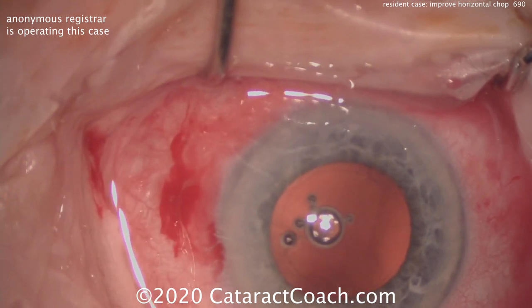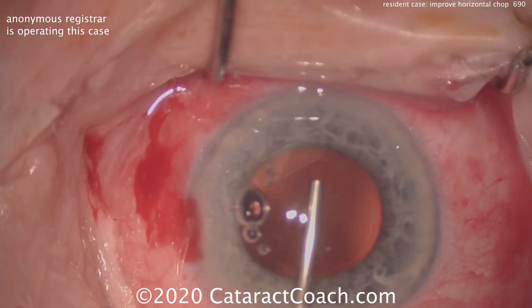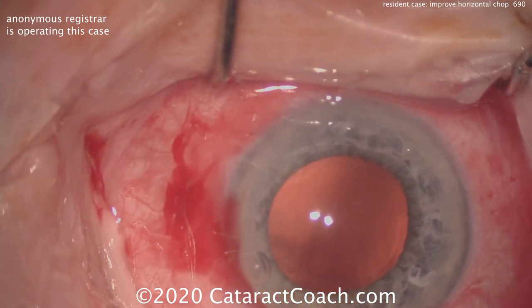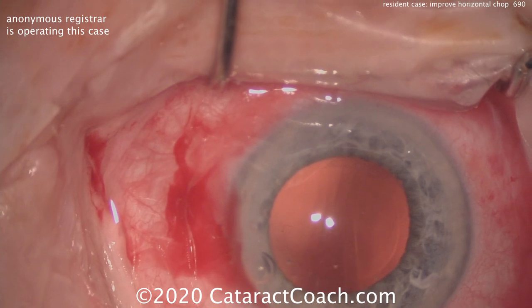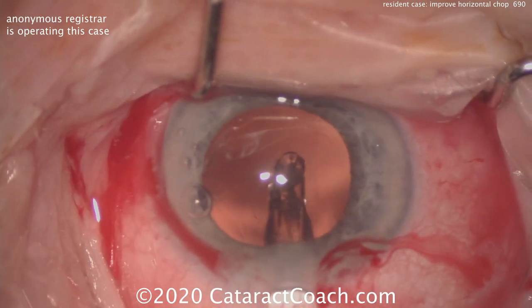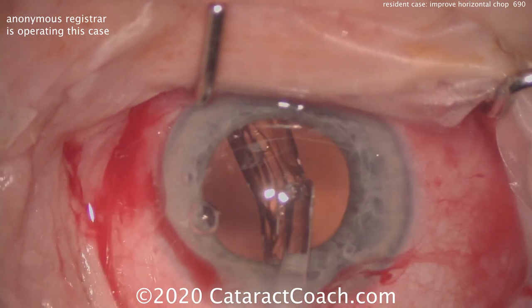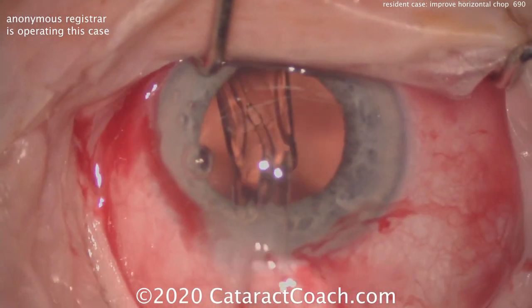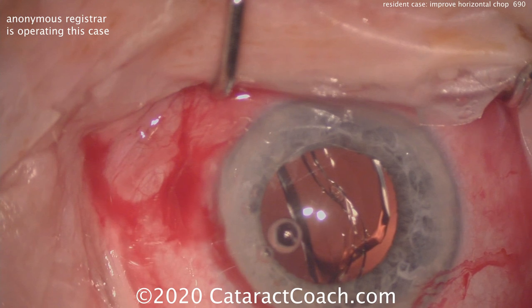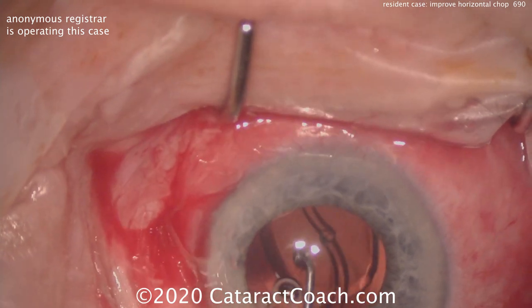Cortex removal looks pretty straightforward — that looks great. It's a nice-looking capsular rhexis here, I like that as well. Filling up the capsular bag with viscoelastic, the rest of the case is going to proceed pretty normally. I like the video, I'm thankful for the submission — there's a lot to learn here. This resident or registrar is doing a really good job, and my suggestion for improvement will make this an even better technique. Here's the IOL going into the capsular bag — pretty nice technique. Let's have it unfold and make sure it goes completely within the capsular bag.